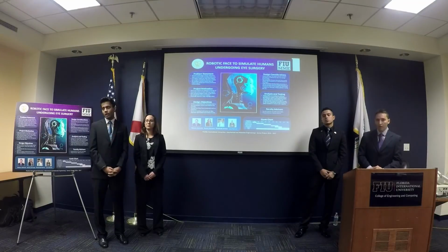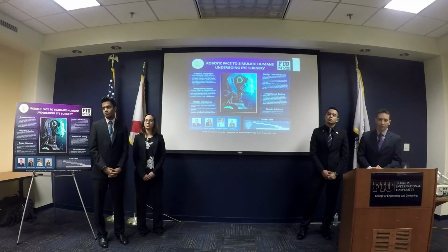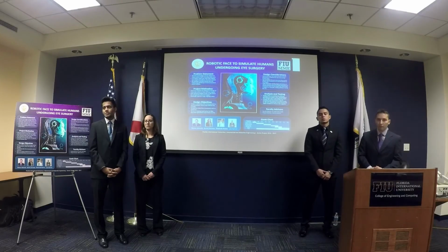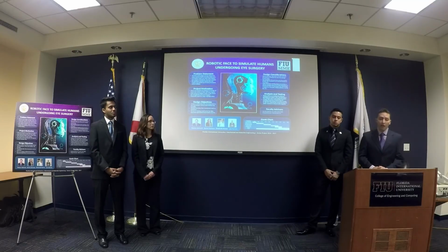That's fine, but you're trying to make it as human-like as possible. When you put this robot under the eye surgeon and they follow the same procedure, they would numb the eye and clamp open the eyelids, and just by doing that you've rendered all your 6 servos useless. So it's really just a mannequin sitting there that you won't be able to move. Have you considered following the same design with a different application, moving away from the eye procedure, or targeting the eye procedure without the servos, but making sign language your primary focus?